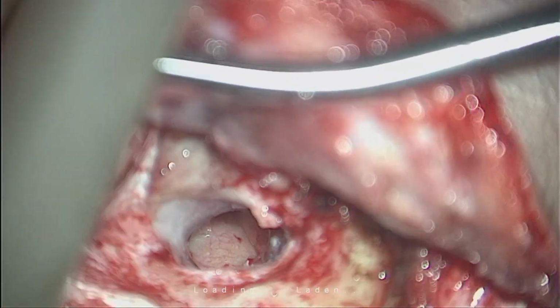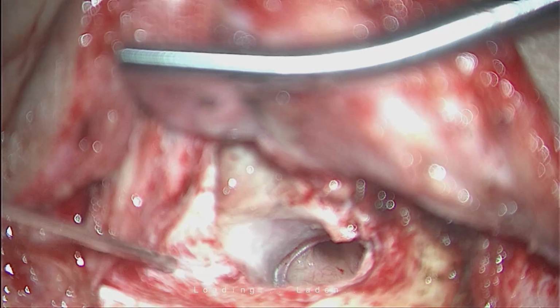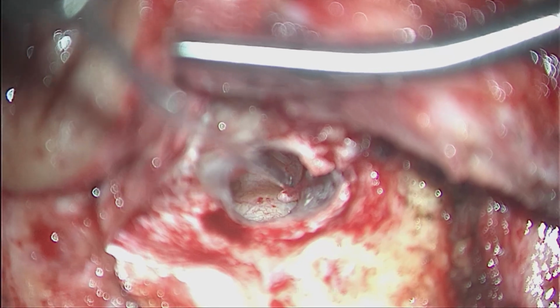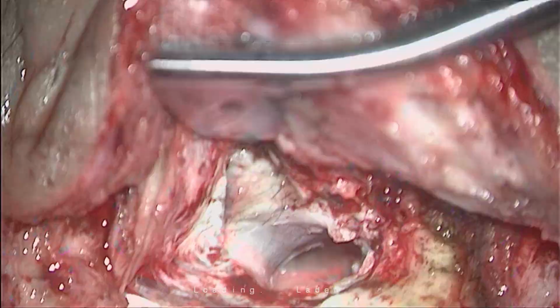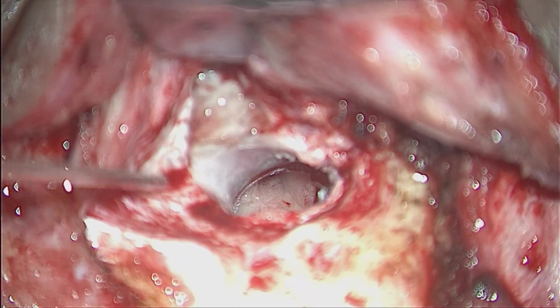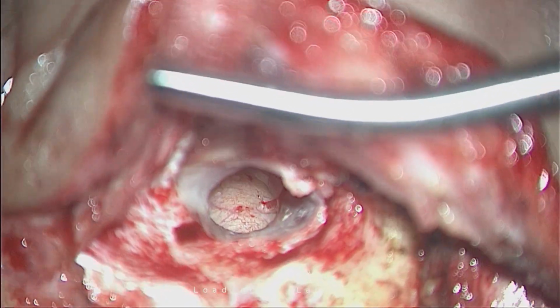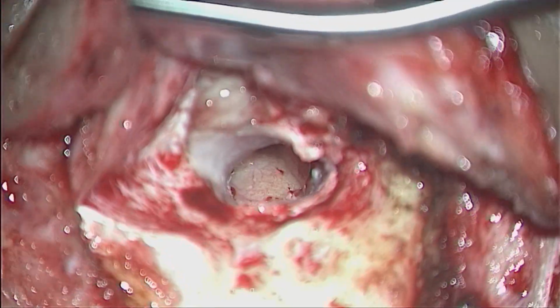See, this is the subtotal perforation. You can see margins all around. Our proposed technique is interlay, which has an edge over other techniques in such perforations. I am not criticizing the other techniques, but there are certain disadvantages which we need to discuss. For underlay, in such a subtotal perforation, keeping the tympanic membrane graft underneath these narrow, small margins is very difficult. You can do some tucking or an additional incision entry, but that may not sustain a sudden negative pressure in the post-operative period, and the graft may fall. Interlay means interposing the graft in between the layers of the tympanic membrane, which I am going to show you.